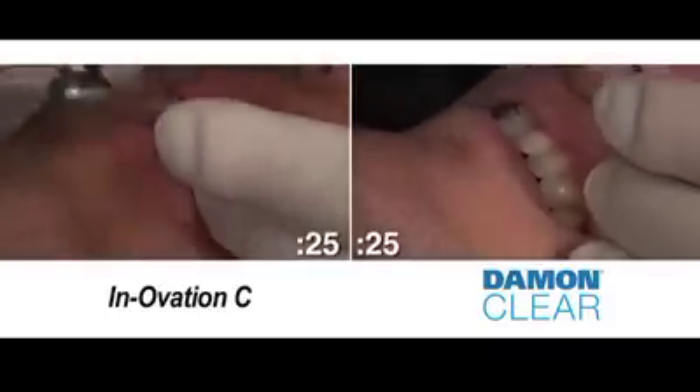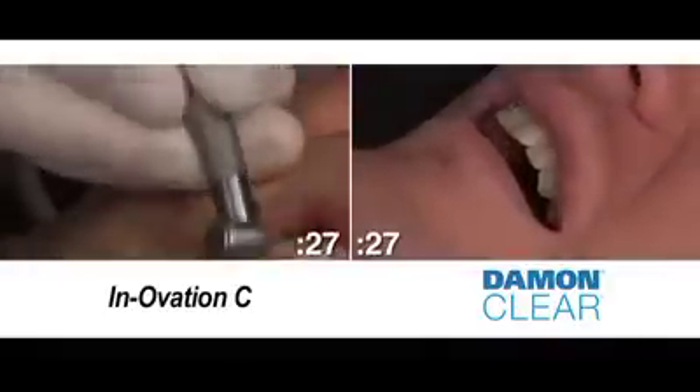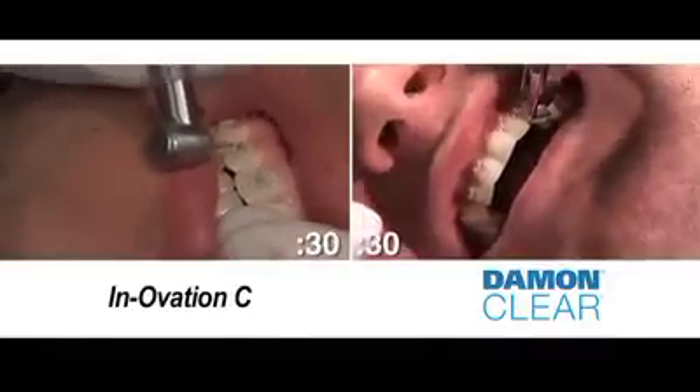With Innovation C, several instruments are required for debonding. Damon Clear simply requires the Damon Clear debonding instrument.